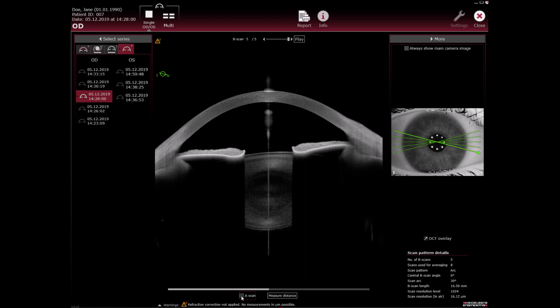To hide the B scans on the camera image, clear the OCT overlay checkbox.